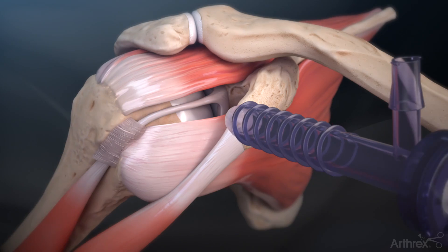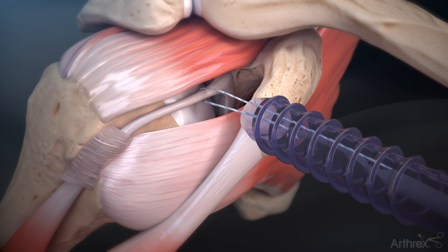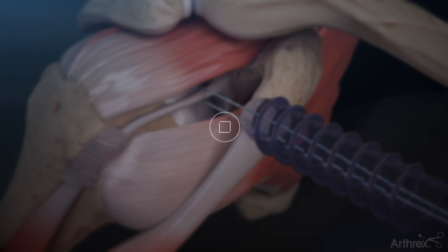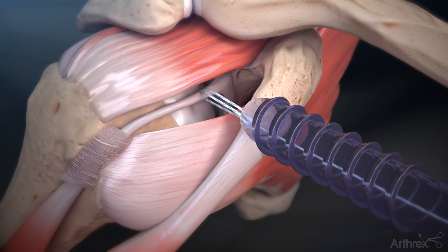Using the LupinTac swift stitch suture passer, introduce the tail end of the suture tape fiberlink suture over the top of the biceps tendon and retrieve from below the biceps tendon through the cannula. Insert the free end through the loop to create a cinch stitch with the fiberlink suture and advance around the biceps tendon.